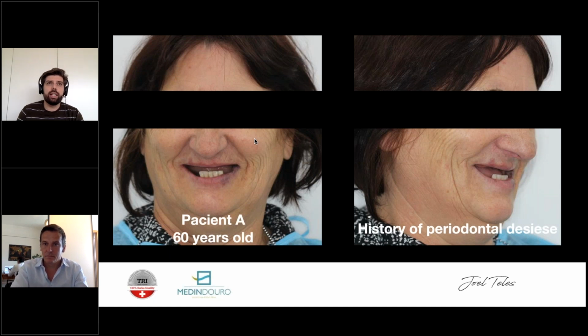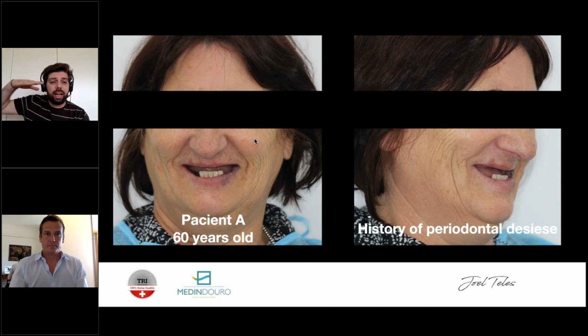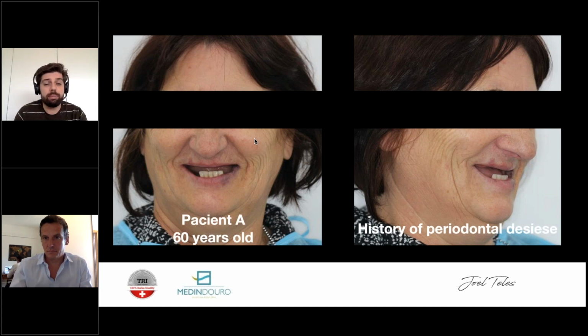There are some tricky cases. Actually, if you go and see the second webinar we did, the final case was one of those cases. We needed to cut in the bottom, and we didn't have that much to cut. There are some bone reduction limits that you should be aware of, but that will only happen in a small amount of your cases. And regarding resorption, it depends on the resorption. If it is regarding height, then maybe you only need to do the flattening and that's it. The tougher cases will be the ones where the sinus is too pneumatized. So maybe you need to do first a sinus lift and afterwards bone cutting. It may happen in cases like this. They are not very common, but that may happen.